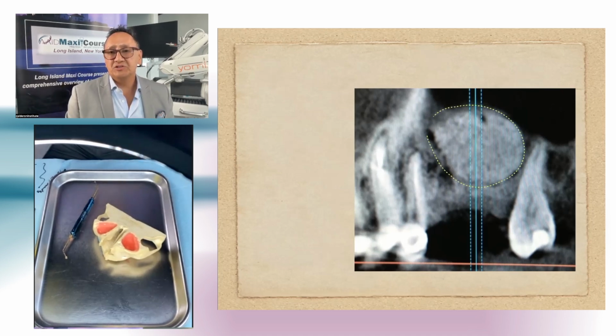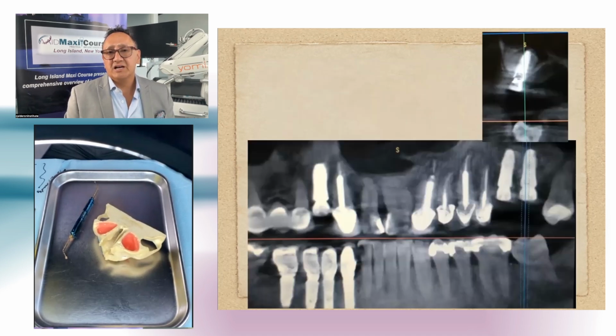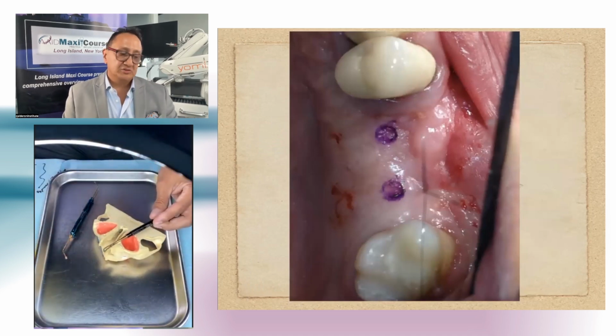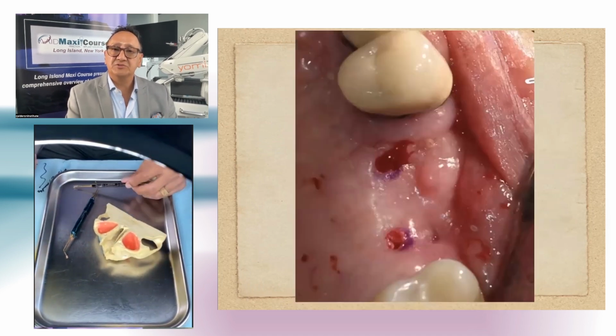So as we go forward, this is what it looks like. And this is what it looks like on the crosscuts, right? And this is what the implants look like 6 months later. That's what we did. So this is where the plan is. Where I usually use a Thompson stick to mark that. I like to use my Calderón instrument that I showed you beforehand. This is for spacing, the Calderón implant spacing instrument. And we use that to reflect everything and also do our surgeries.